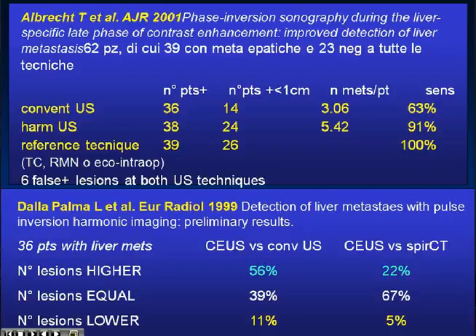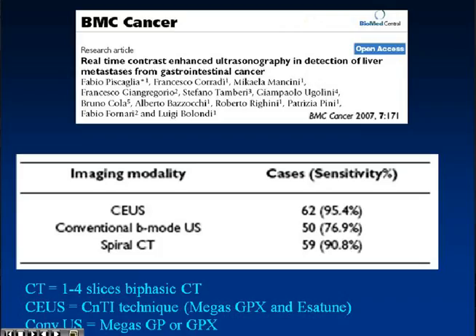And then these figures subsequently confirm that CEUS is able to see some lesions that are missed by helical CT. This is another manuscript of the same period which confirmed this data, and we have also had a similar experience. These manuscripts were all a little bit old when we think of contrast CT examinations. So now we have more performant CT scanners, but also better ultrasound scanners.